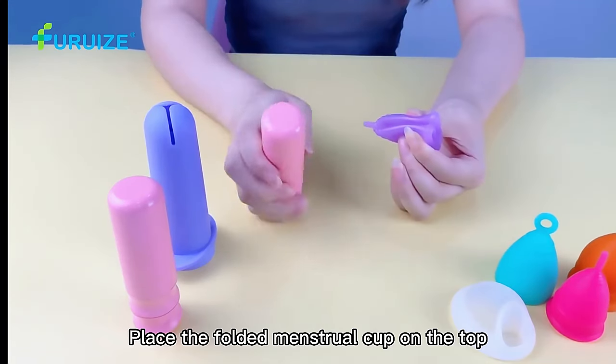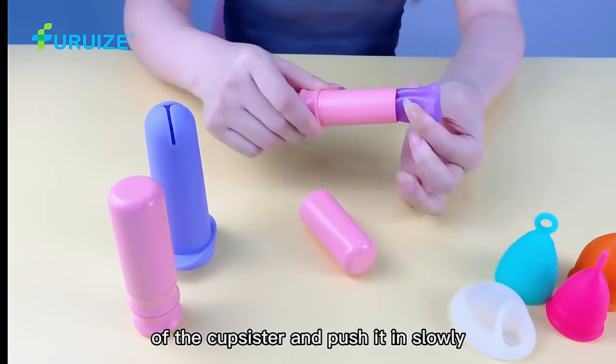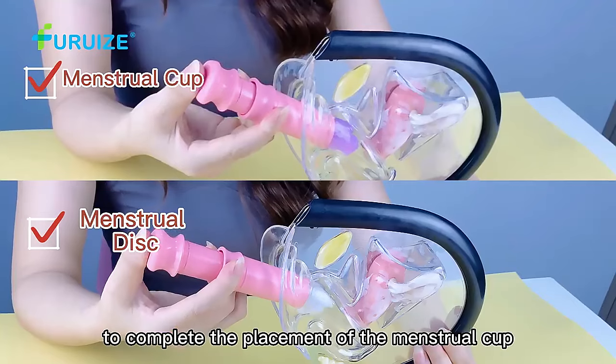Place the folded menstrual cup on the top of the Cup Sister and push it in slowly to complete the placement of the menstrual cup.